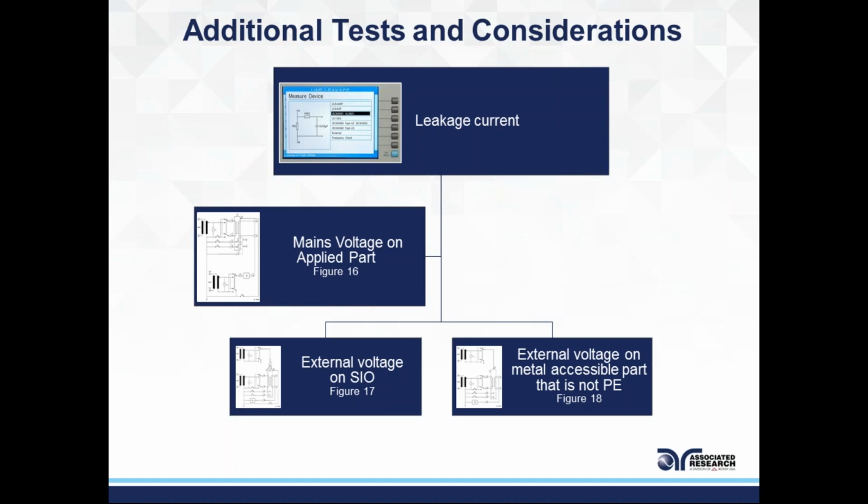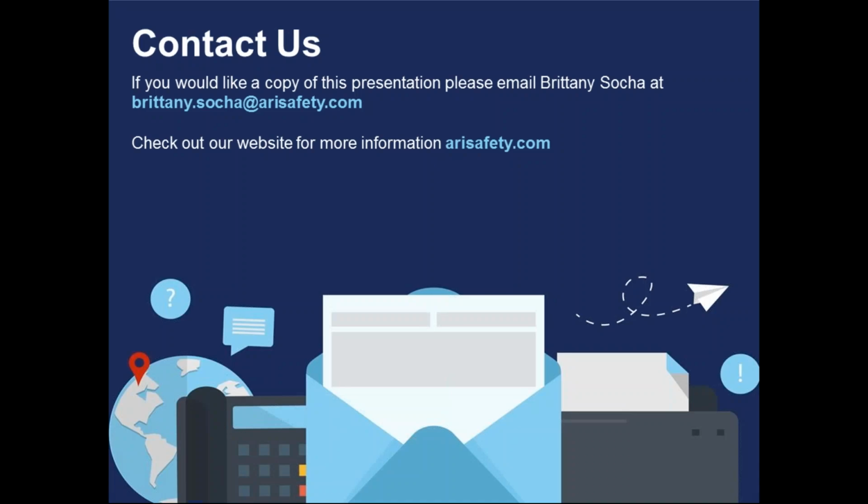But we're able to achieve all those setups just by breaking down the figure that they're referencing and how all these figures correlate to how our instrument is doing the test. It may require additional equipment like the scanning matrices to do this in a fully automated fashion, but there's no saying that this can't be done manually. If you have enough time for somebody to go connect different points, it could be done manually, but that puts you in a position of not knowing if the test was performed properly or not. So using scanning matrices does allow you to perform the test in a fully automated fashion.